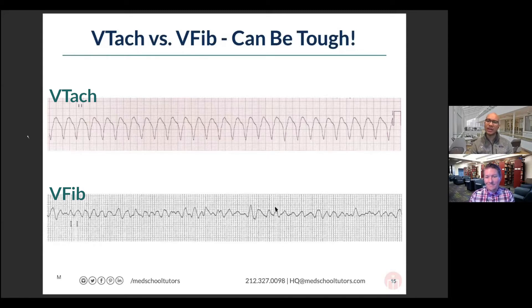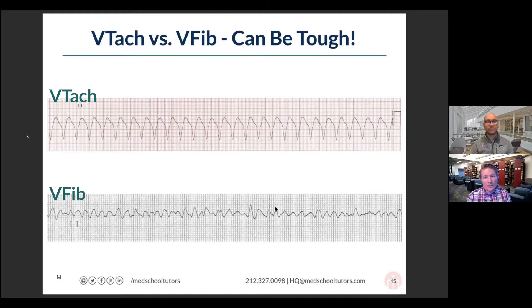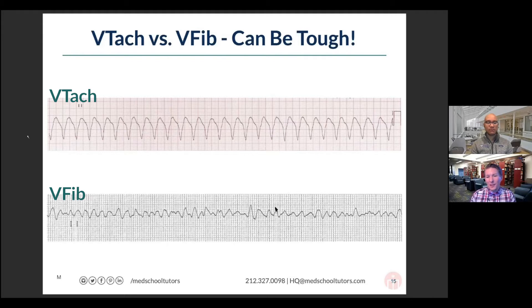One thing that always stood out to me is that the VTac appearance often has a description as looking like shark teeth. Shark teeth are very sharp and pretty regular. If you imagine looking into Jaws' mouth, you can kind of see that top picture as having a shark tooth appearance.